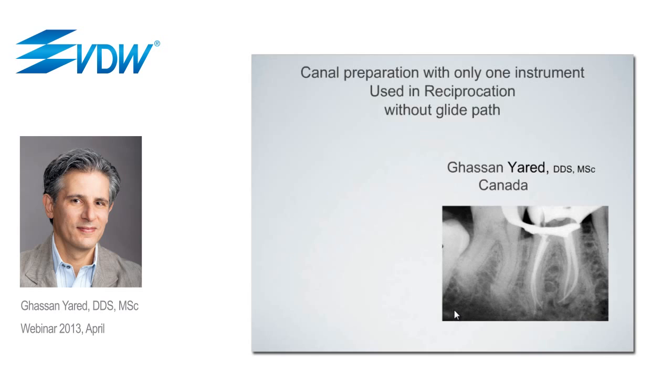There are some cases where we will have to create a glide path. There are cases where we will have to use hand files before using the reciproc instrument, and I will discuss this later during the presentation.